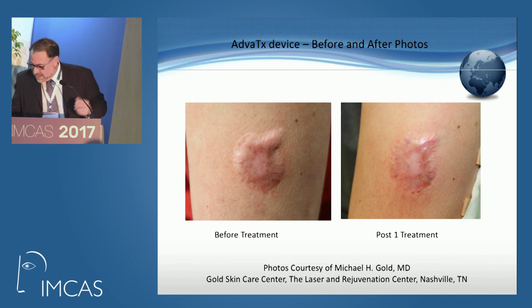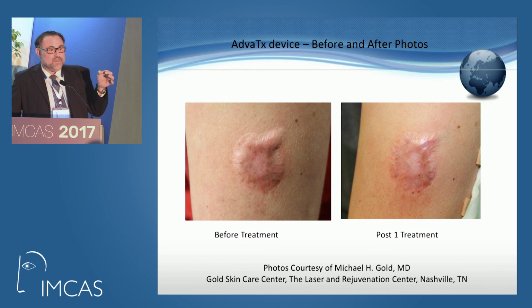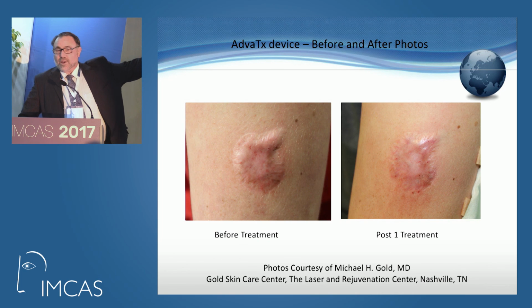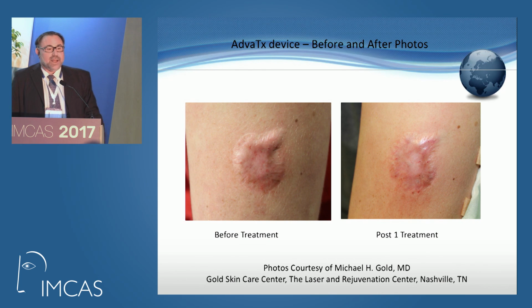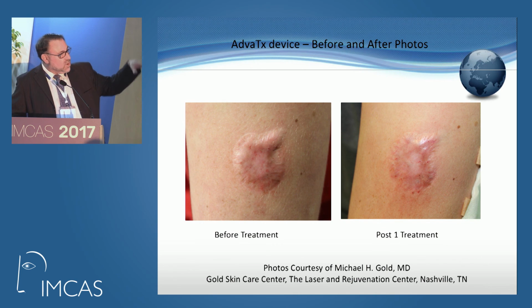And this was a fascinating individual. This person is a young boy whose friend decided to take the equivalent of a €2 piece and heat it up and then stick it on his arm. And that was the hypertrophic scar that resulted. I just saw him back a couple days ago, and in one treatment it was about 80% flat, which was remarkable. So we were really pleased with that, treating the vascular component. I told him he couldn't get treated a second time that day because he had to do something, but we're planning on doing at least one more treatment.